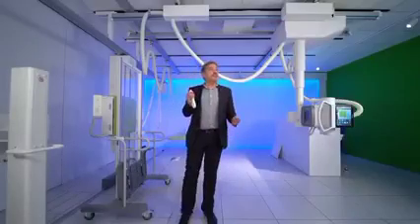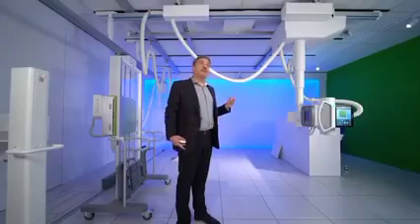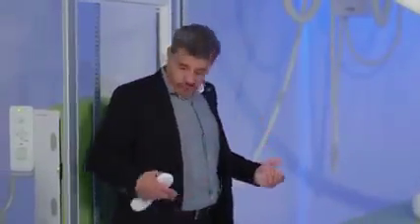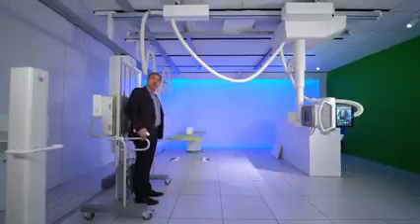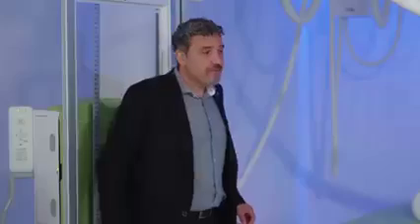Another examination you might need is stitching. Stitching of the full spine or the full legs just by creating 2 or 3 exposures while the system will stitch those images together automatically. How it is done with the C90, it's very simple. The patient is going to stand in front of the wall stand, either on top of this footrest, or for spine, they can just stand on the floor. They can comfortably hold on to the system to find more balance and to stand in a stable way.